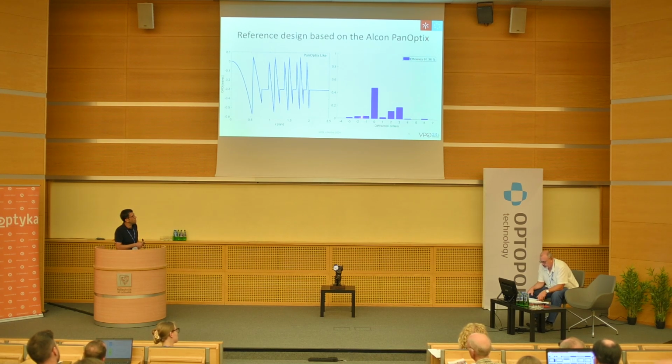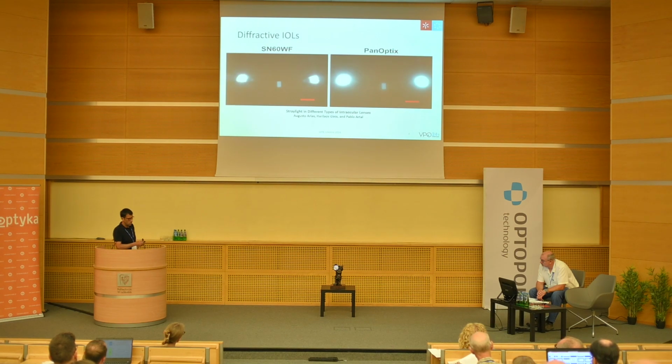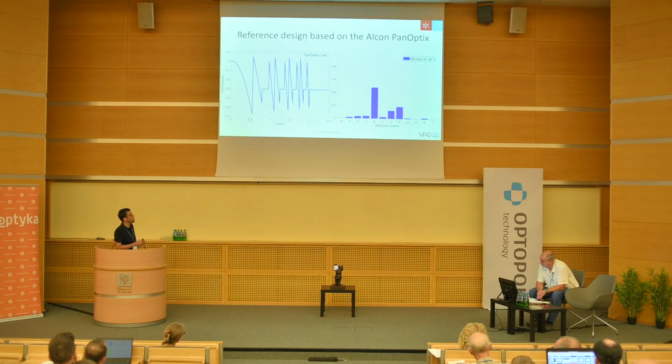You lose part of the energy to these higher order harmonics. These are focal distances, multiples of the principal focal distances, where some light goes through. And this contributes to the halos that you were seeing before, this light that you see around bright light sources. They do not contribute to functional vision, but they decrease the image quality and increase night vision symptoms.